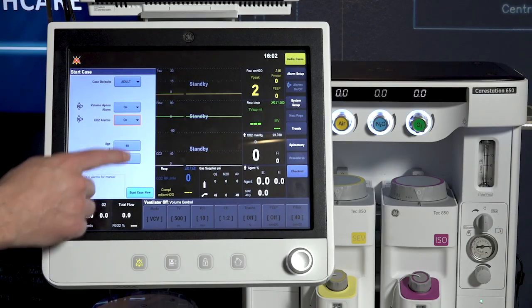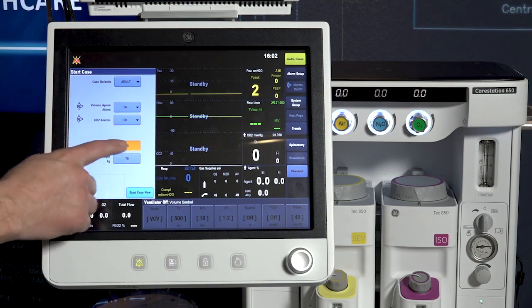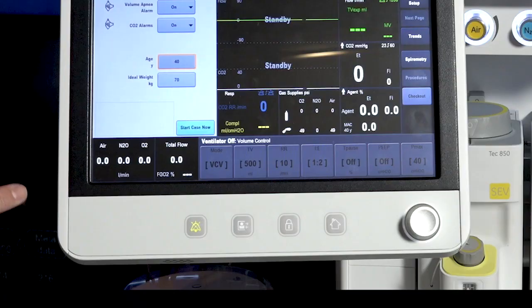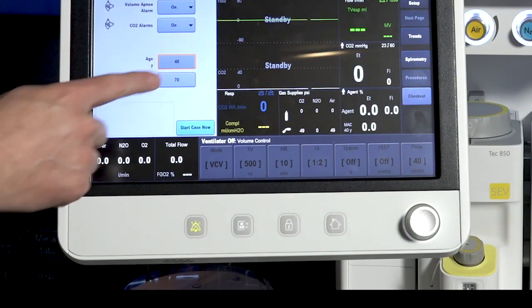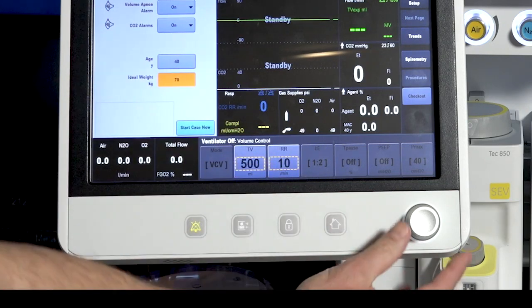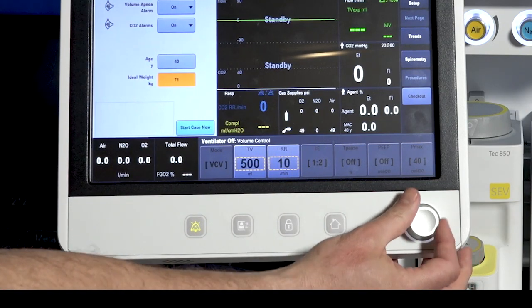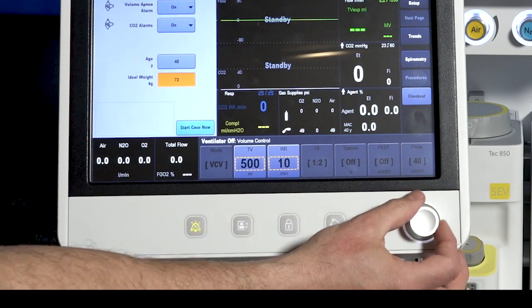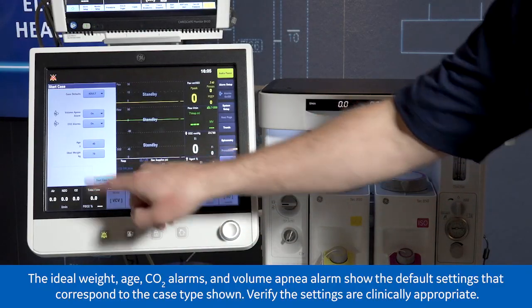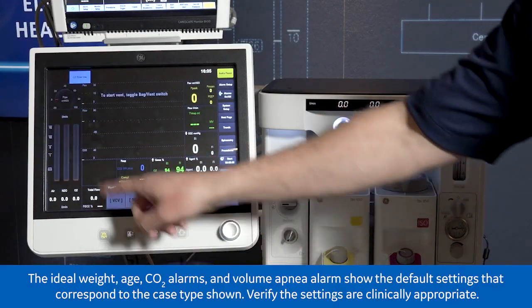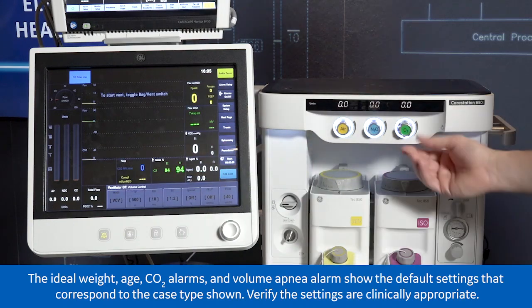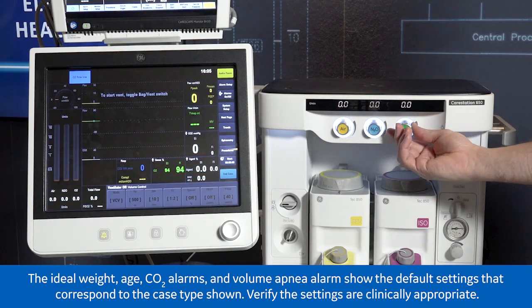To enter your patient's age, select age. To enter your patient's weight, select weight. Select start case now and start the gas flows by adjusting the air and oxygen flow knobs.